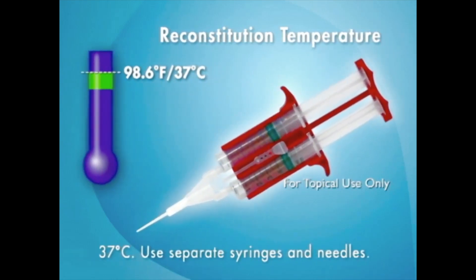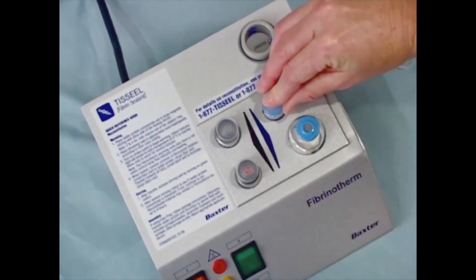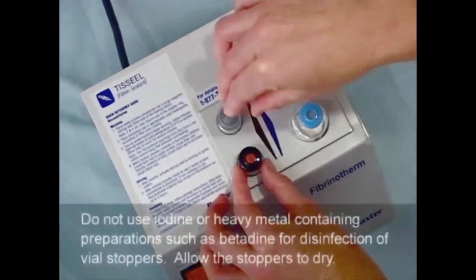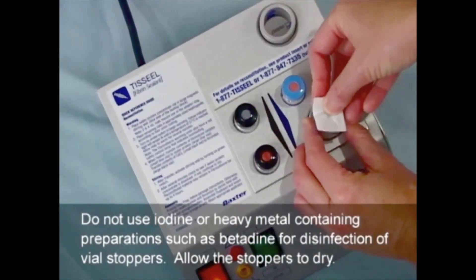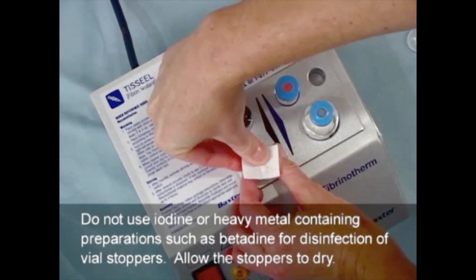The syringes and needles necessary for this step are provided in the kit. Be sure to use separate syringes and needles for reconstituting the sealer protein and thrombin solution in order to prevent premature product activation and clotting. Remove the flip-off caps from the vials and disinfect the rubber stoppers with a non-iodine-based disinfectant. Do not use iodine or heavy metal-containing preparations, such as betadine, for disinfection of vial stoppers. Allow the stoppers to dry.